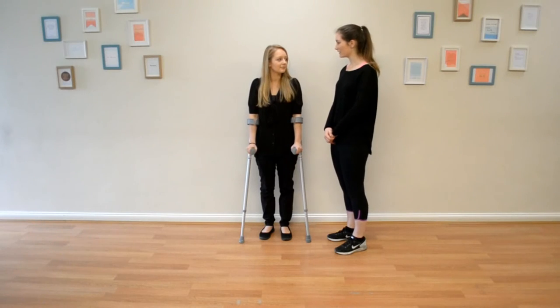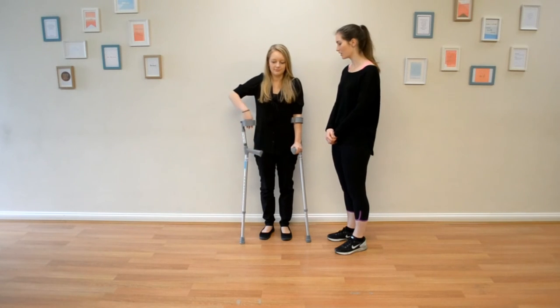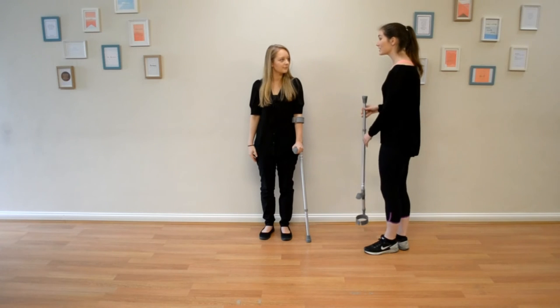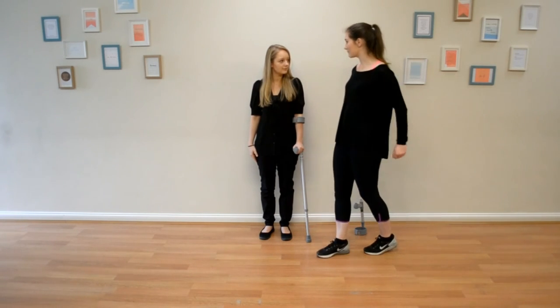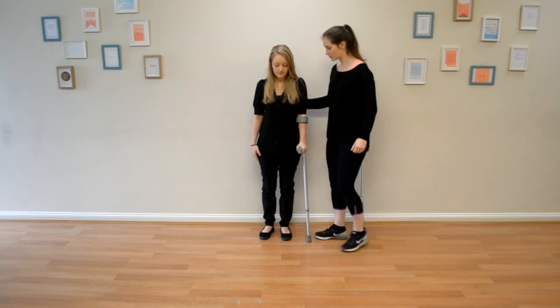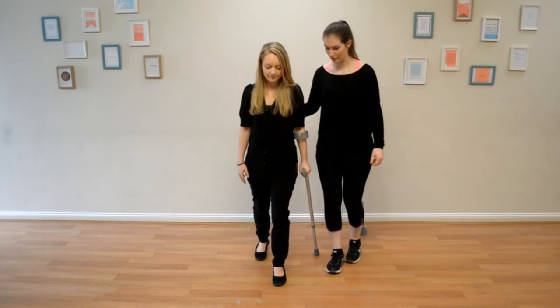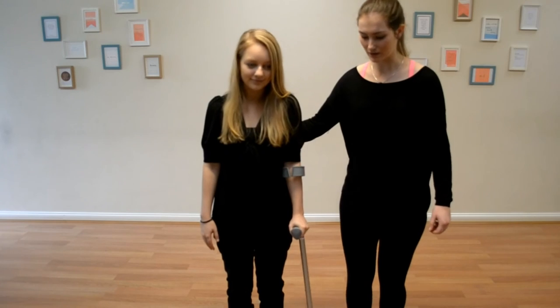Alex is now on her way to recovery and the aim is to get her off crutches. Because Alex has hurt her right knee, we want her to use her left crutch to walk. Now it's very similar to what we were doing — stepping through confidently. The crutch and the sore leg still go together and the good leg comes to your own side.